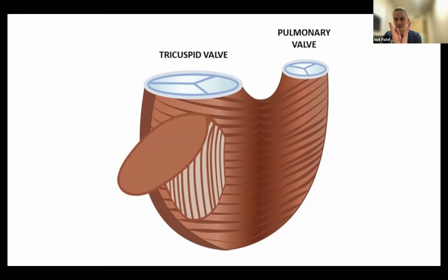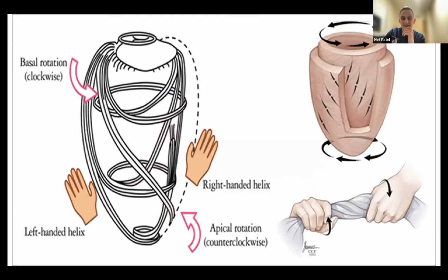So when those circumferential fibers contract in the right ventricle, they don't so much cause that narrowing of the donut that you see in the left ventricle. Instead, they cause more of a bellows action, so a squashing of the right ventricle up against the left ventricle. And because of the overall morphology of the right ventricle, as I showed you in that first picture, it's actually really hard in 3 dimensions to get a full sense of that longitudinal and circumferential contraction of the right ventricle and that bellows action that it makes. The left ventricle is actually easier because of its symmetry.